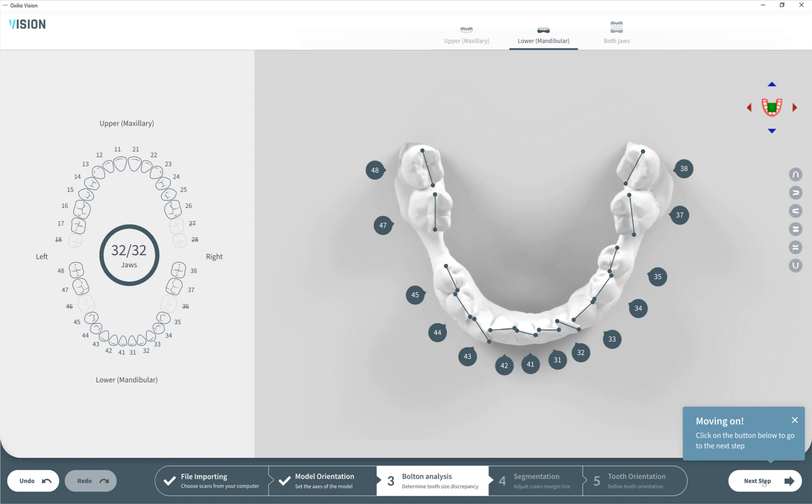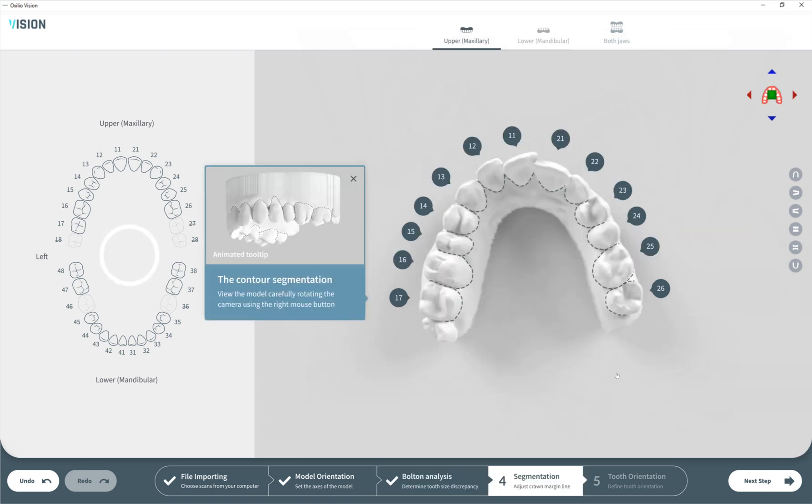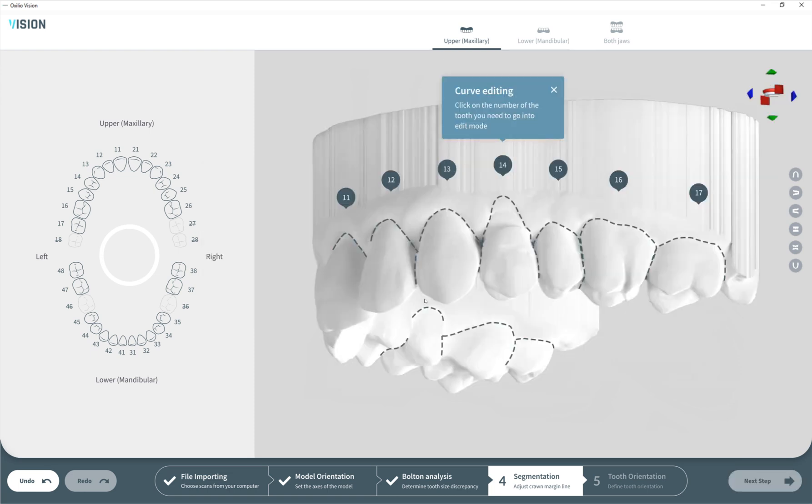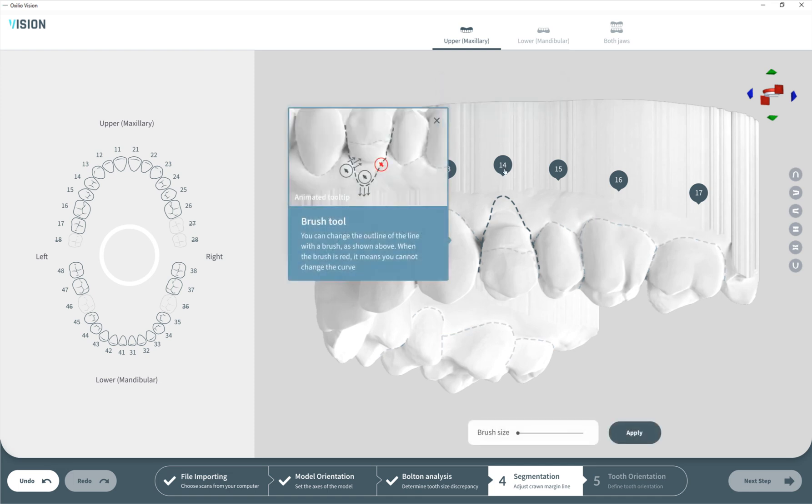Let's move forward. Here in step number four we're dealing with segmentation. Right after the third step, the software will automatically segment teeth from jaws with a very cool algorithm. But of course sometimes it doesn't work 100% correctly, so we have an option to edit those segmentation lines.